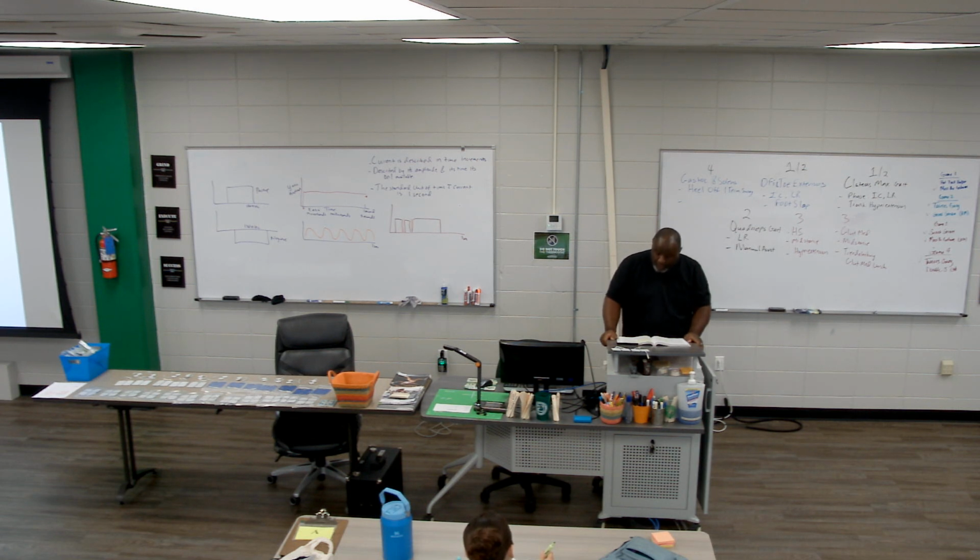It is found that although symmetrical biphasic is preferred on large and small muscles, when used on stimulations with small muscle, it is not discrete in its recruitment, and sometimes it can overflow, meaning it's getting into other tissues. Not in a bad way.